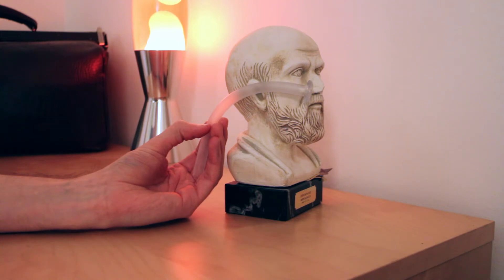Contraindications to its use include suspected base of skull fractures, and the complication of its use includes damage to the nasopharyngeal region.